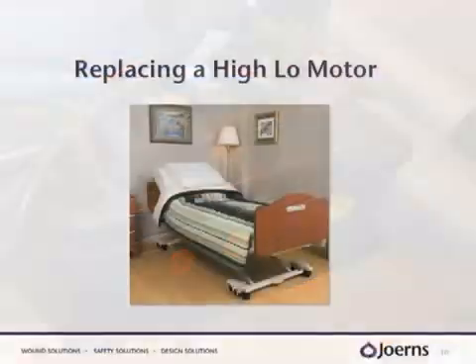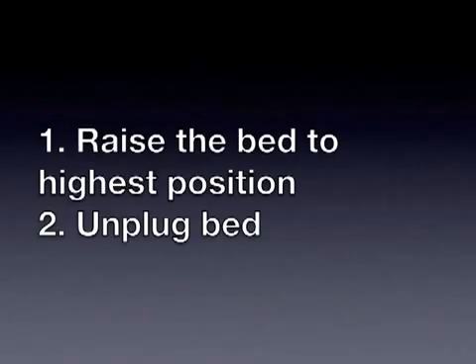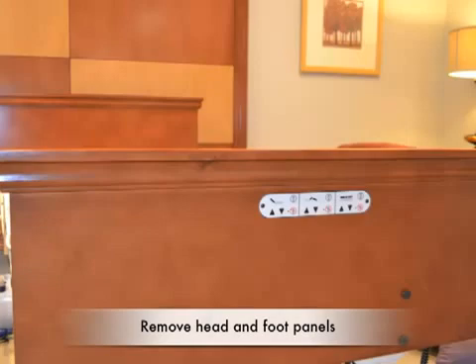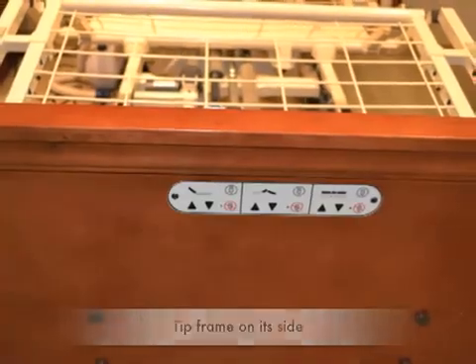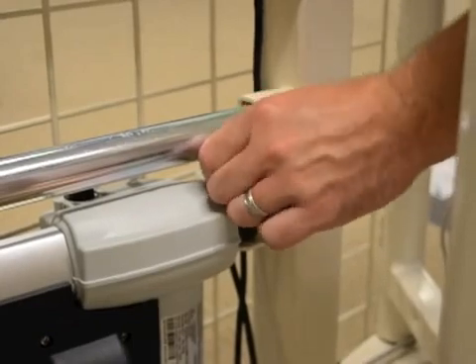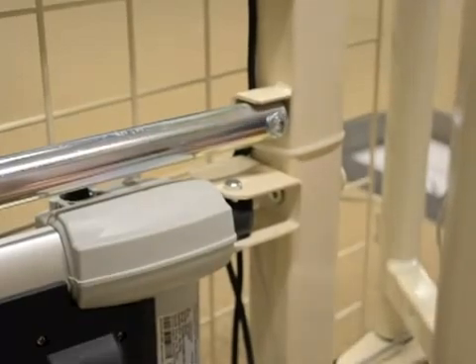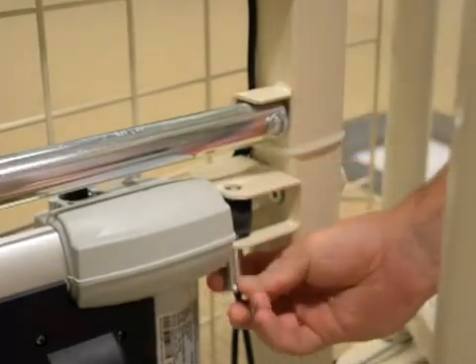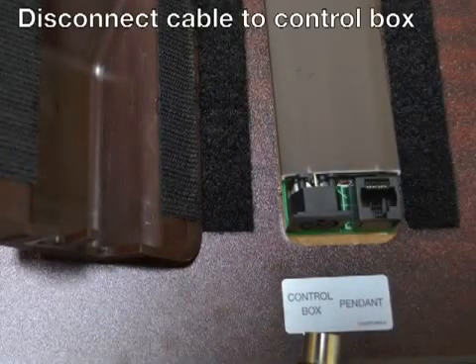If you need to replace one of the high-low motors, raise the bed to its highest position if possible and unplug the power cord from the wall outlet. Remove the head and foot panels so that the frame can be tipped onto its side. Using the needle nose pliers, remove the rue rings and slide the clevis pins out of each end of the actuator, taking note of the orientation of these pins as they must be reinstalled in the same direction. Discard used rue rings and clevis pins. You will then need to disconnect the cable running to the control box.